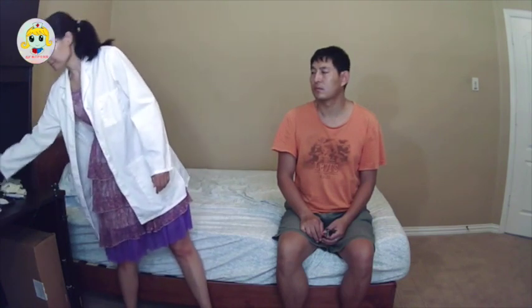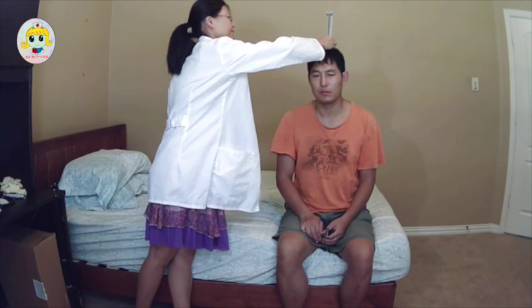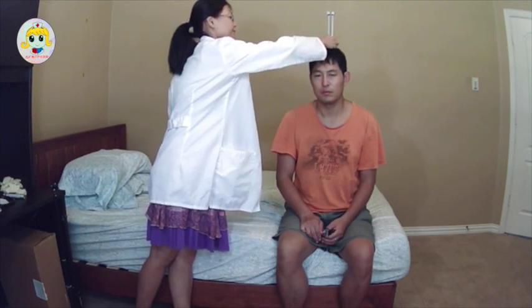Next, I will do the Weber and Rinne tests. This is a tuning fork. I will put it on the middle of your head. You tell me whether you hear the sound equally in both sides, or one side is louder and the other side is weaker, okay? It's equal. Okay. Next, we will do the Rinne test.